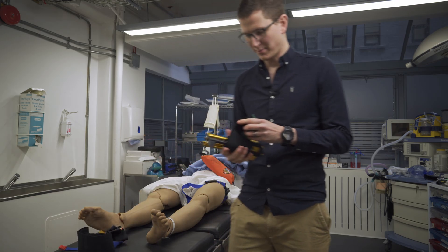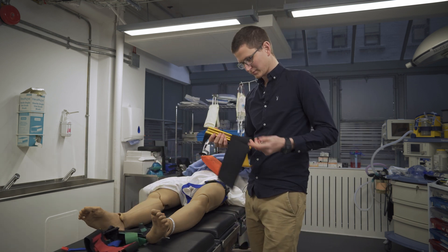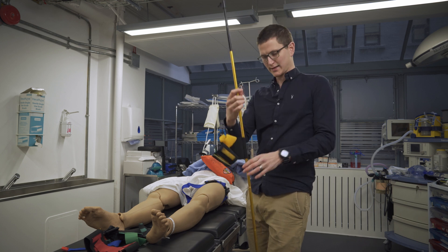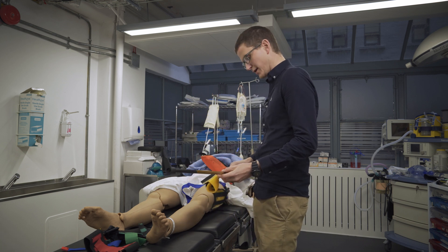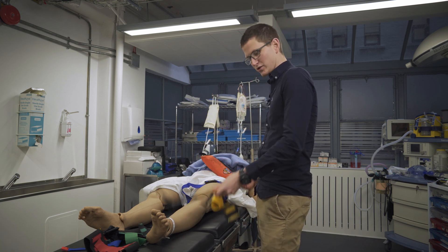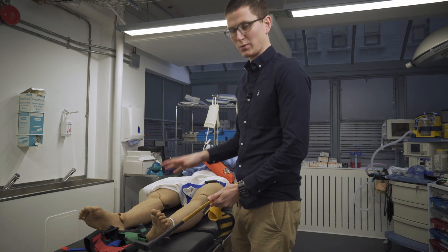We're then going to get the poles. The poles will remind you of a tent — and that's exactly what they are, tent poles. The most important point, and the biggest failing I have noticed, is that the poles aren't measured correctly.